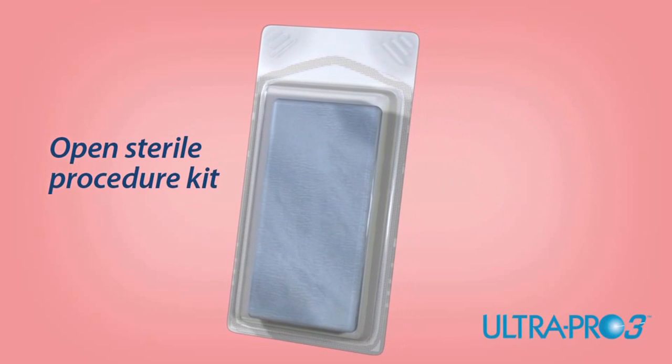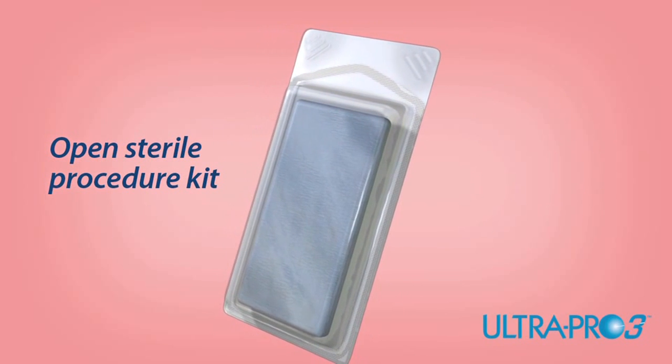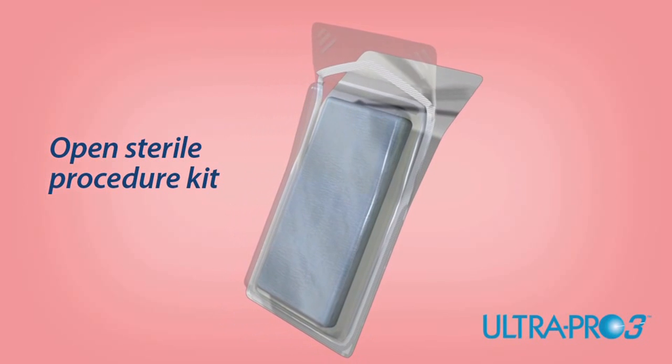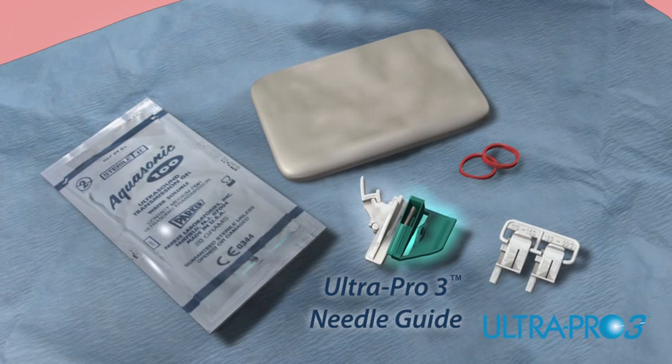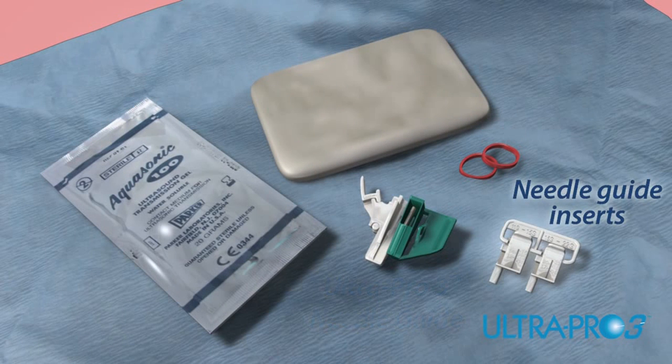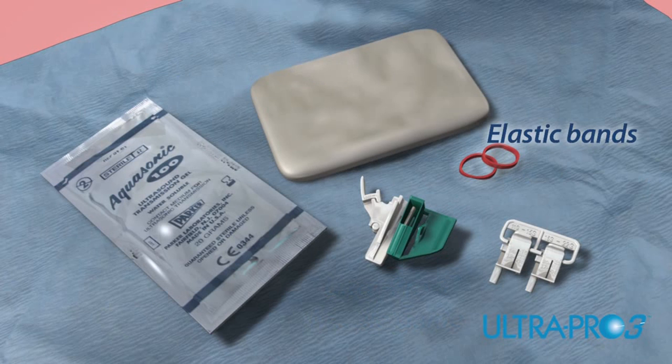Each needle guide is conveniently packaged in a sterile procedure kit. Using proper sterile technique, open the UltraPro 3 needle guide procedure kit. Inside, you'll find an UltraPro 3 needle guide and needle guide insert, CivFlex transducer cover, gel packet, and colored elastic bands.